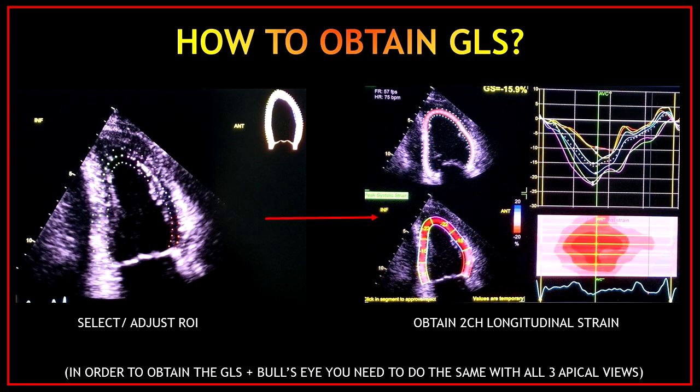Remember that in order to obtain the global longitudinal strain and the bullseye, you will need to do the same with all three apical views. If you are happy with this, just click approve and select next. Two done and one more to go — let's do this one more time.